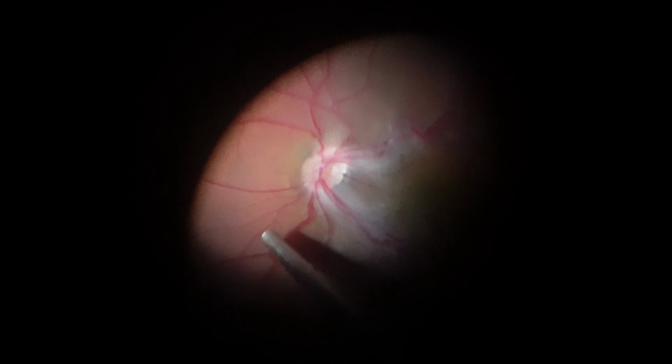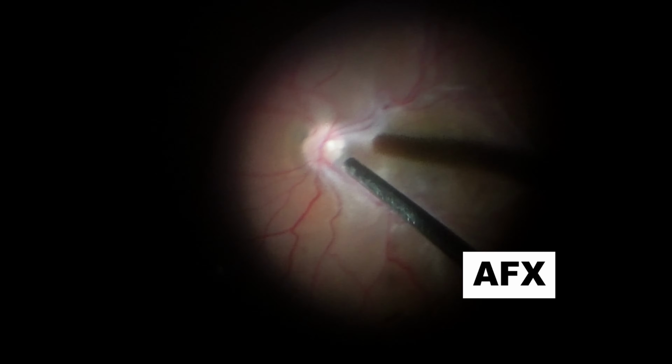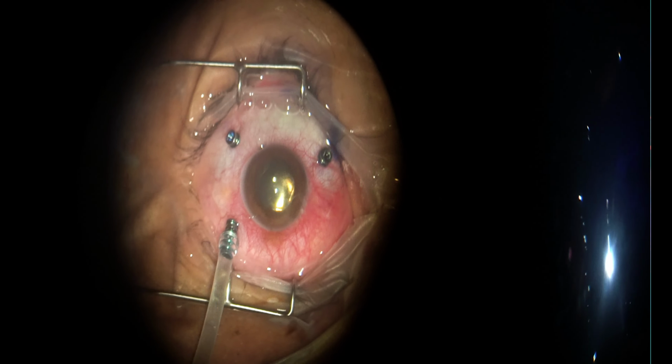With a macular lens, you have a great view of the fundus for an AFX, air-fluid exchange. A complete AFX is performed so that enough brilliant blue will be injected towards the macular surface for a good staining. Brilliant blue is injected carefully on the macular surface. There is no need to pass the arcades for the staining.